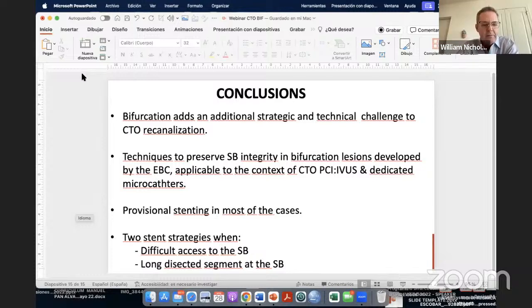We've had some nice cases too, where you do have flow into that side branch, but you have your carina shift, or you have a dissection flap like you described, blocking access to the side branch. We've had a few of those, not a ton, but maybe 5 or 6 that we've been successful with reverse wiring from the recanalized branch.